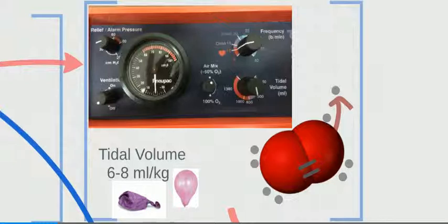This is an ATV ventilator, so it's not a high-end ventilator that has all the bells and whistles, but we do have some other things that we can mess with and utilize. So far we've covered tidal volume and FiO2. More often than not, keep it on FiO2, or keep it on 100%.